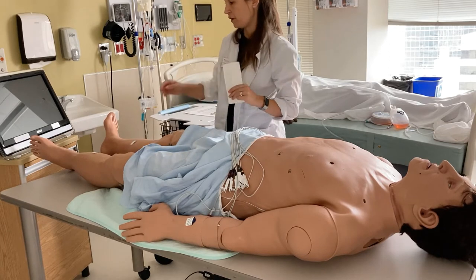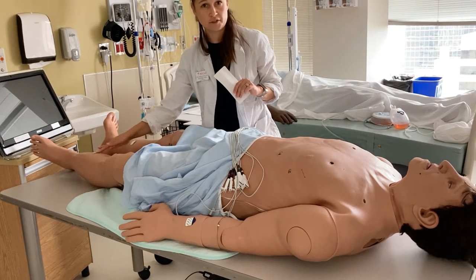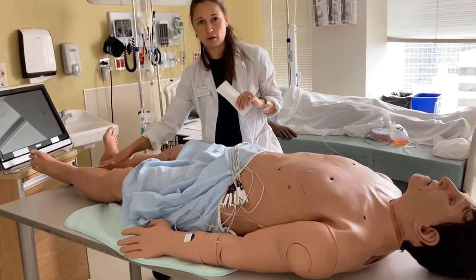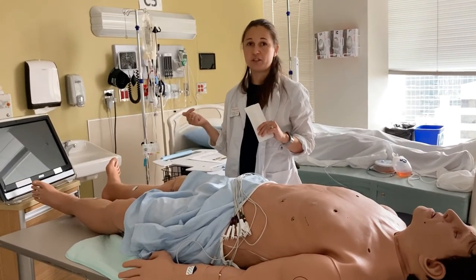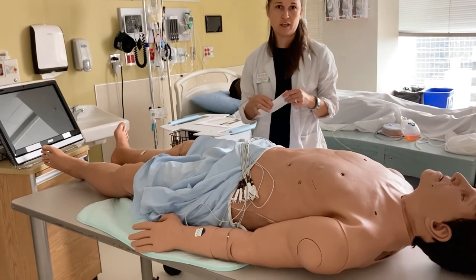If the patient has a lot of hair and you're having trouble sticking your electrodes, or if the skin is oily, you might want to clean the skin with an alcohol-based solution — just an alcohol wipe. For the chest electrodes, it is an option to clip the chest hair if the electrodes will not stick.